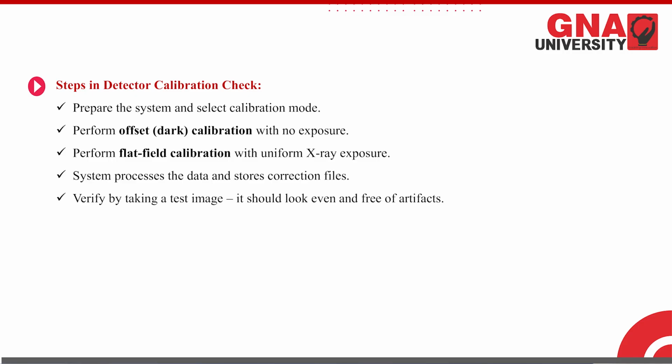After that, verify by taking a test image. When these calibrations are done, that means any issue which was noted is resolved now, and we have to verify it once again. Take a test image and it should look even and free of any artifact. If that test image is free of any artifact and is even and uniform from one corner to another corner, then that problem is resolved in the detectors.